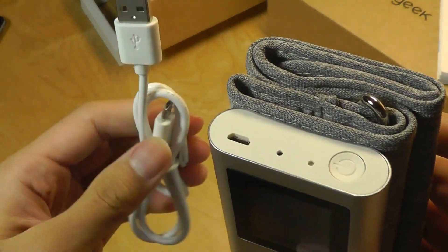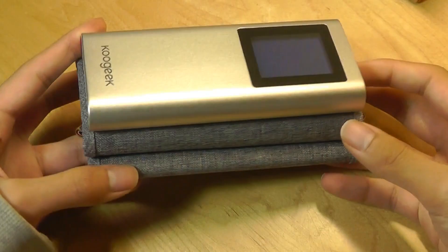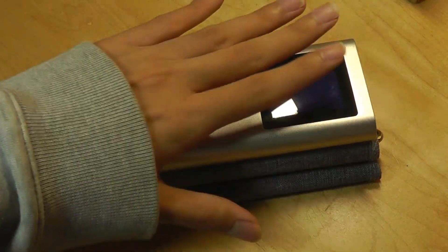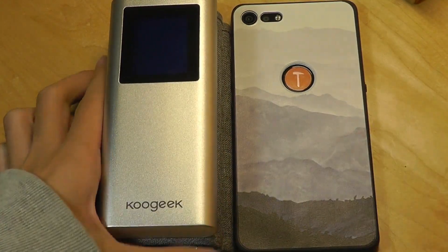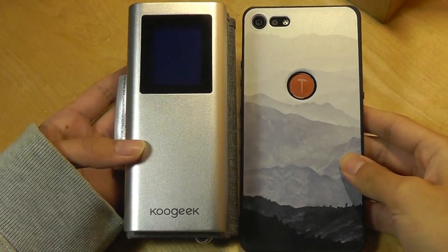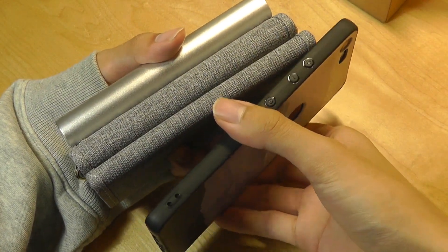The blood pressure monitor recharges using micro USB, takes about two hours to completely recharge, and afterwards you can use it for about a month. In terms of dimensions, it reminds me a lot of something like a power bank — maybe 10,000 milliamp hours. If I put it next to a typical smartphone with a 6-inch display, you get a better idea of the overall size. It's very compact, a lot smaller than a typical blood pressure monitor, and easier to just put into a backpack when you're on the road.